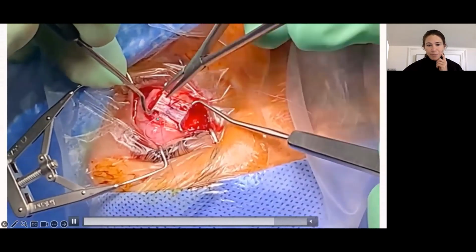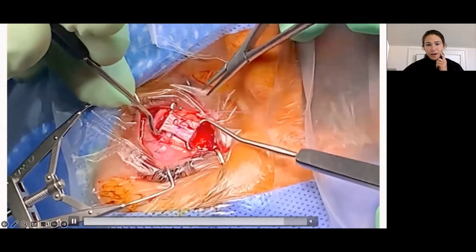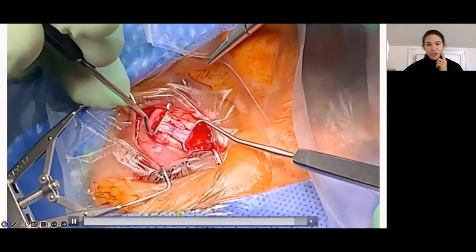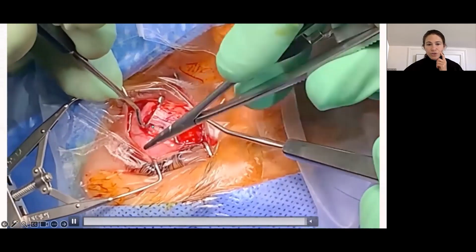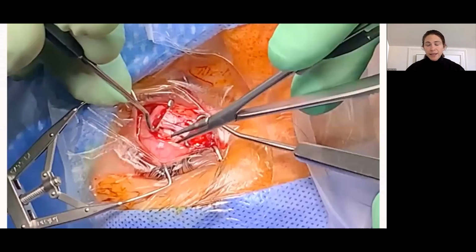This knot will create an air hole if you just pull this vicryl here. So you have to stop yourself and pull back on the suture so that the loop is flush with your tissue. Once the loop is flush with your tissue, then you pull your vicryl all the way through to tighten the locking bite. And this technique, according to Dr. Del Monte, will give you more security with the ciliary vessels.